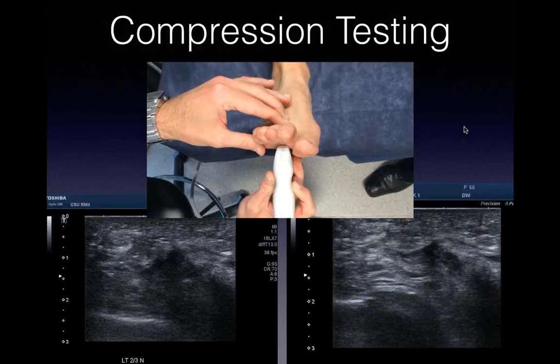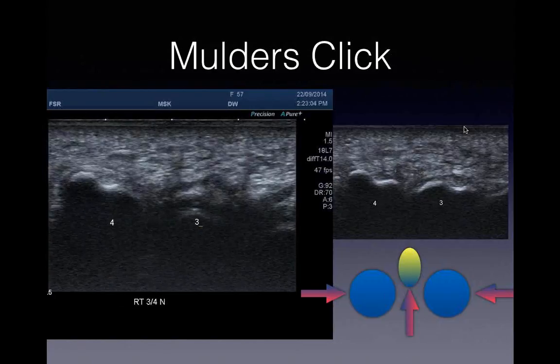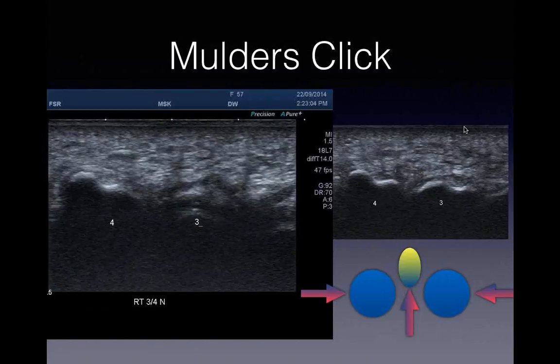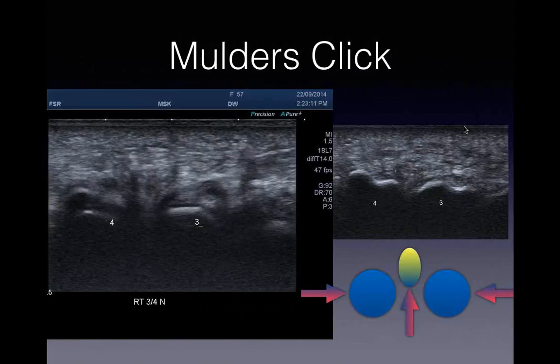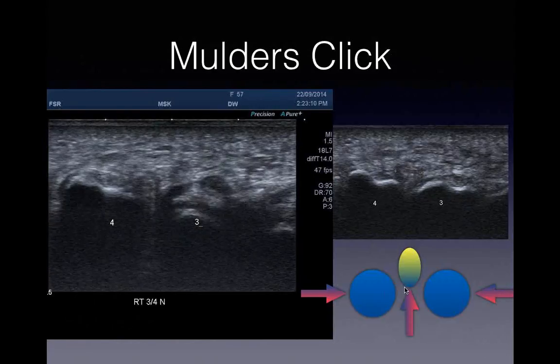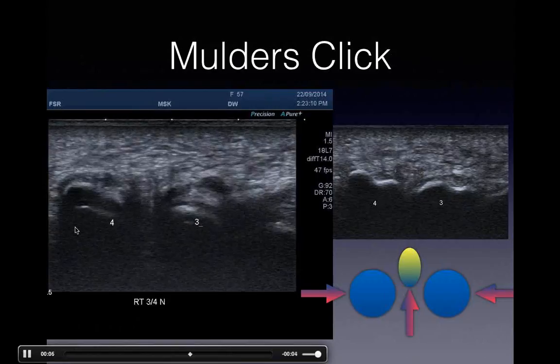Another technique is the Mulder's click - great fun when you get a nice big click. Put your probe transversely over the metatarsal heads, drift a little towards the toes and angle back. Then grab around the foot like you're holding a wet fish and give it a squeeze, applying pressure between the metatarsal heads. Push them together and the nerve pops out plantarly. You get a nice click and often reproduction of symptoms. The tip is you have to push quite hard with your probe as well, otherwise the nerve won't squeeze out.